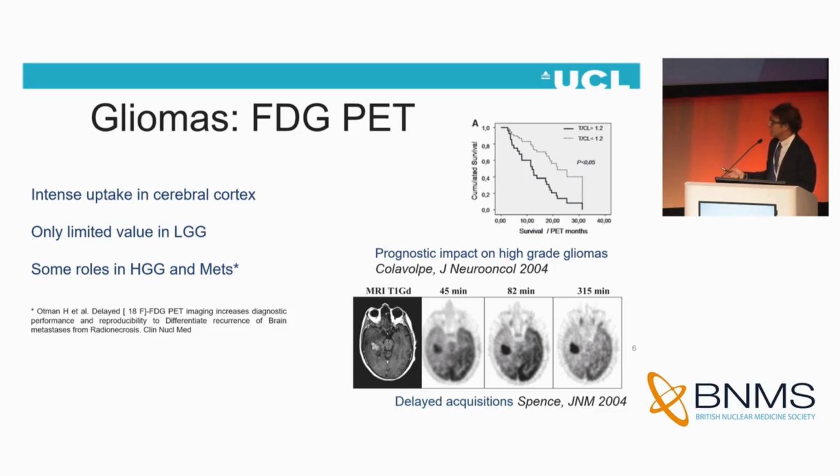With interesting results. Other authors, and this is something that can be done if you don't have any other available tracer, proposed to use the delayed acquisitions, mainly because on one side there is increased activity within the tumor, and then with delayed acquisition there is reduced background activity.